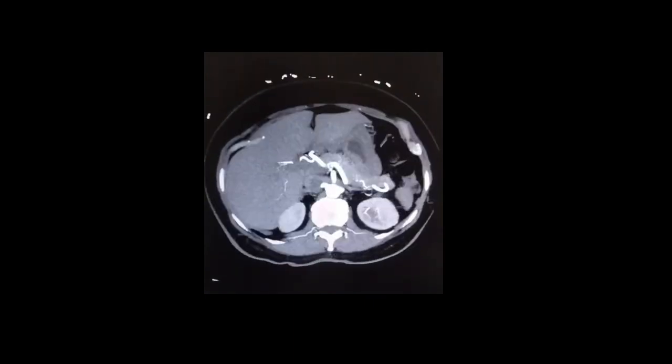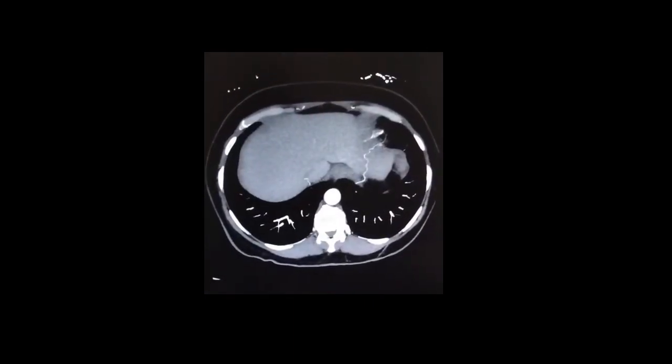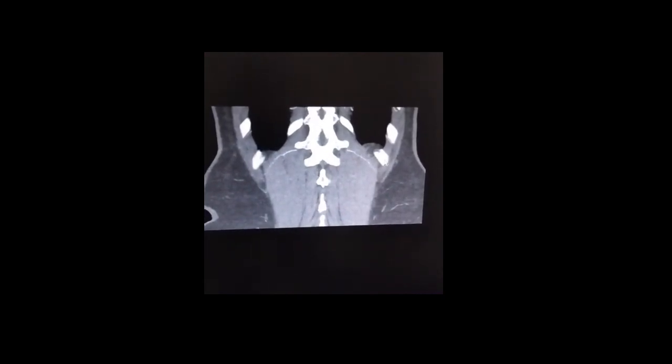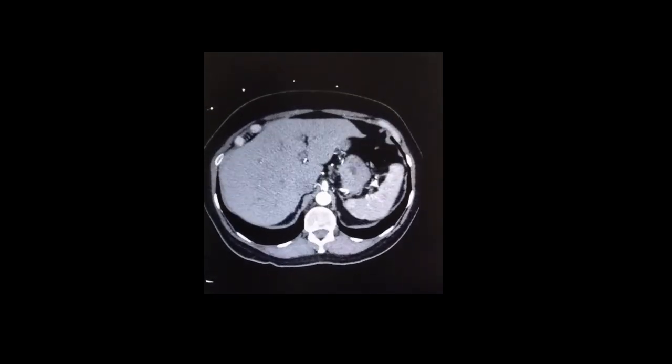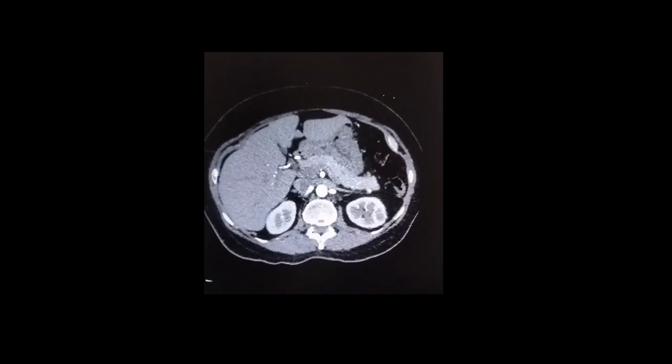1. Early arterial phase, 15 to 25 seconds. Description: the contrast first enters the arteries, highlighting arterial structures. Radiology image reference: look for images showing bright enhancement of arteries such as the aorta, hepatic arteries, or renal arteries. Clinical significance: useful for detecting arterial abnormalities, aneurysms, or hypervascular tumors.